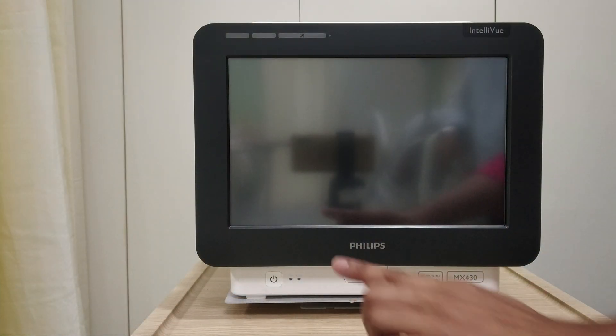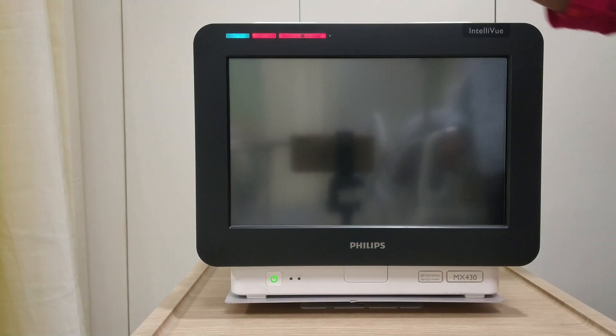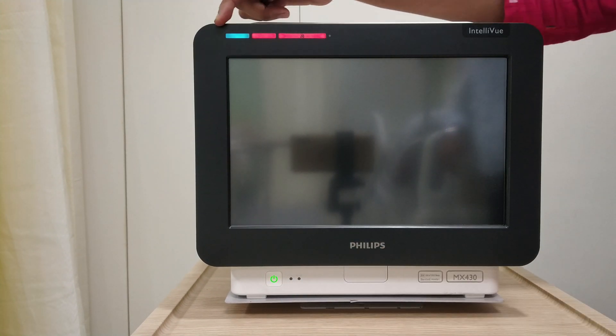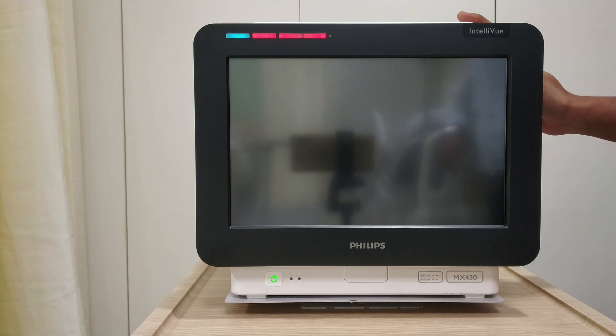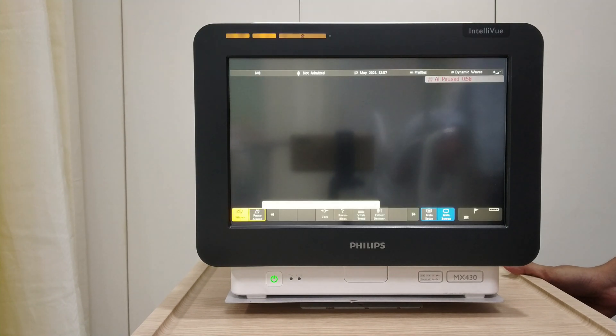Now, front connections — here is the on/off button. These are the alarm indicators. There are three colors: Blue is your technical alarm. Yellow is a mid-priority alarm, that is a clinical alarm warning. And red is a high-priority alarm.